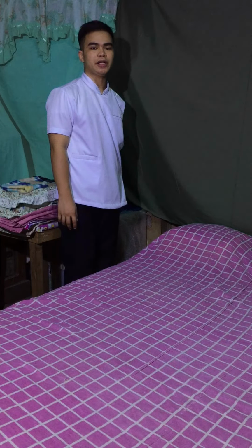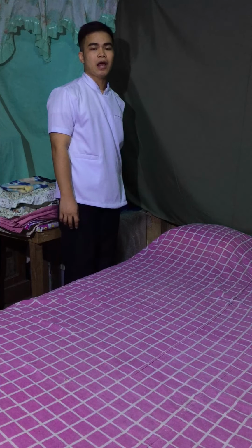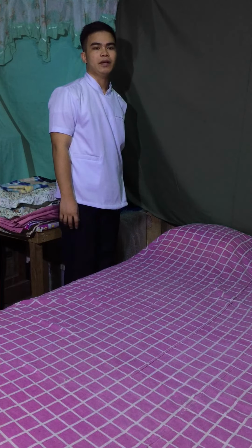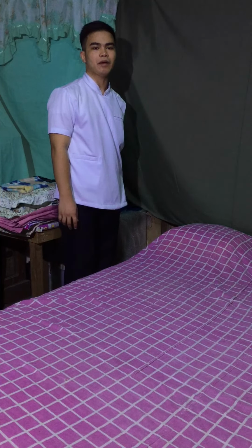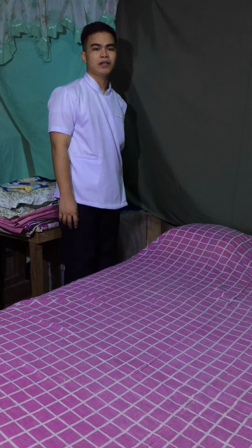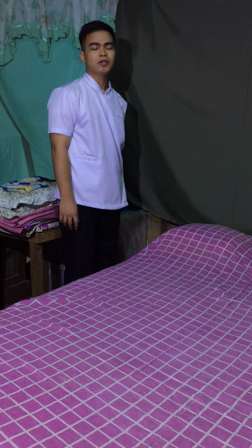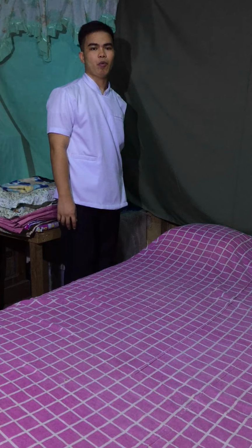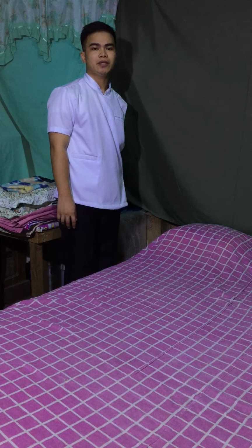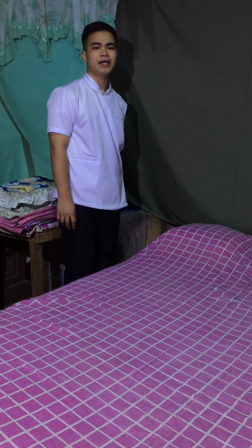Place the folded bottom sheet with its center fold on the center of the bed. Spread the sheet out over the mattress and allow a sufficient amount of sheet at the top to tuck under the mattress. Place the sheet along the edge of the mattress at the foot of the bed and do not tuck it unless contour or fitted sheet. So the top of the sheet needs to be well tucked under to remain securely in place, especially when the head of the bed is elevated.